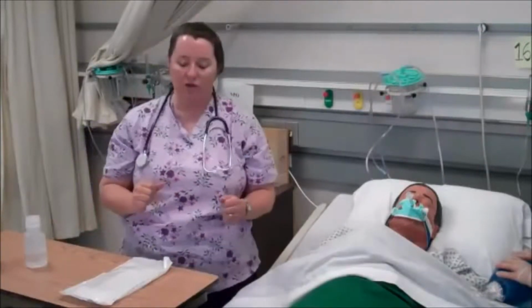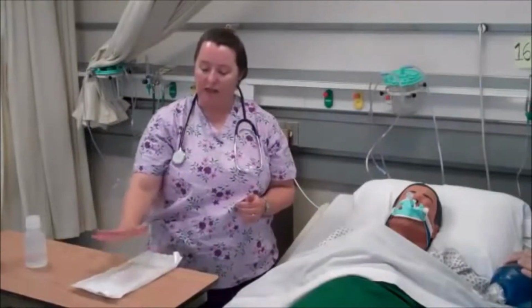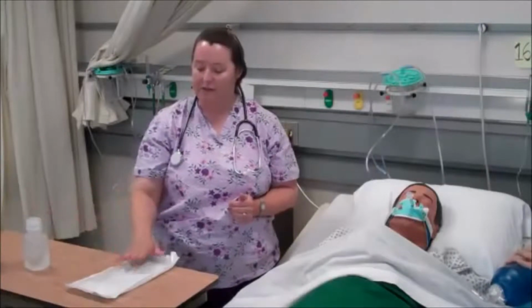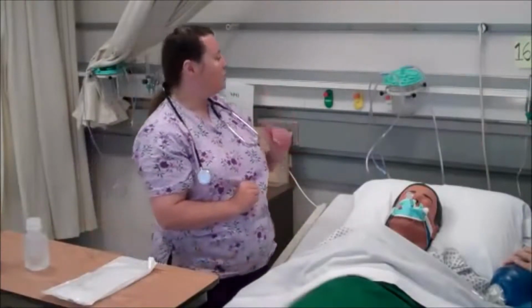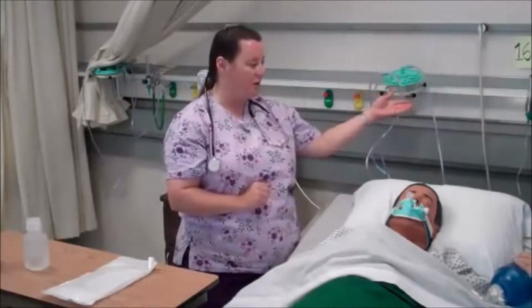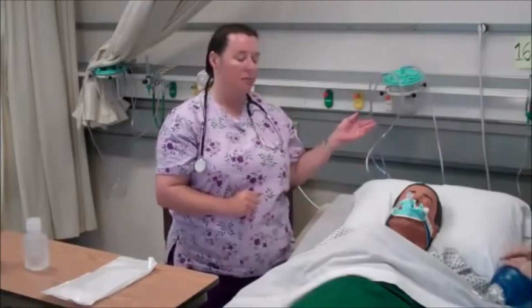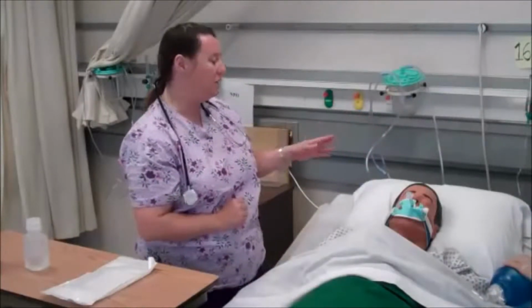I'm going to make sure I gather the equipment that I need. I need my suction catheter kit, and here comes a container for my saline. I have sterile saline available. It's a sterile procedure. I'll demonstrate sterile technique as I go through this. I also want to make sure I have an oxygen source available to me. The patient is on a ventilator right now. We do need to give supplemental oxygen when we ventilate our patient in between suctioning.